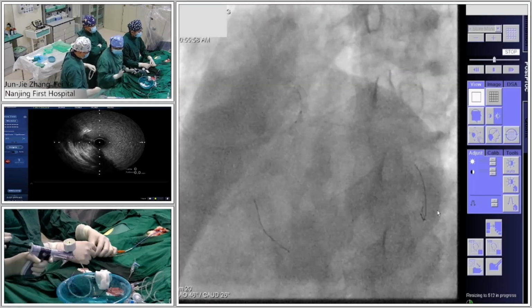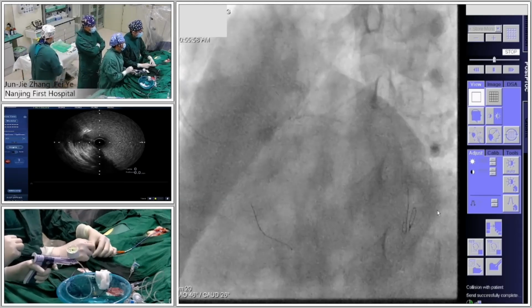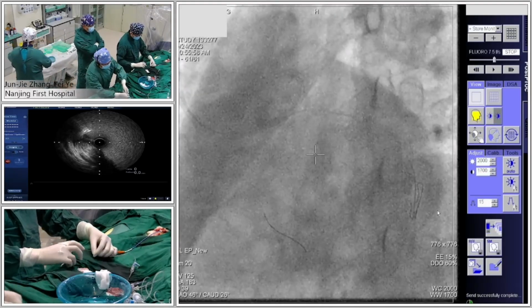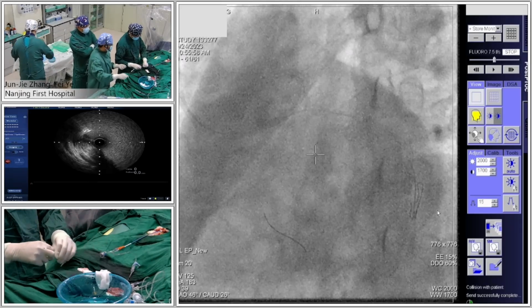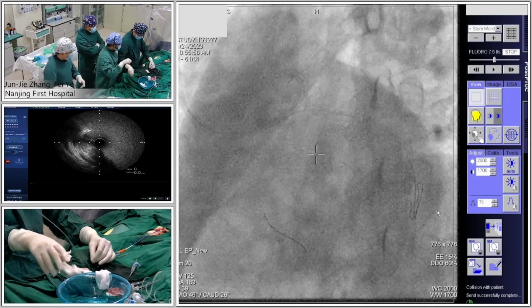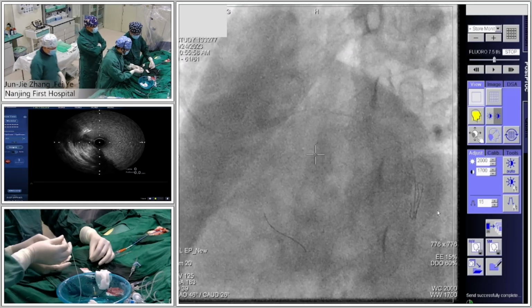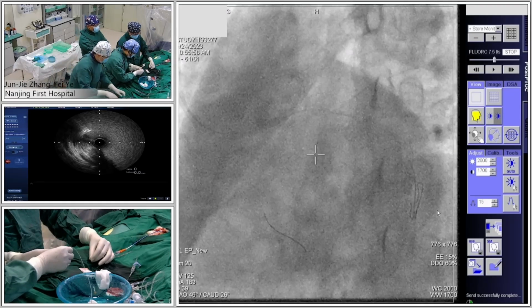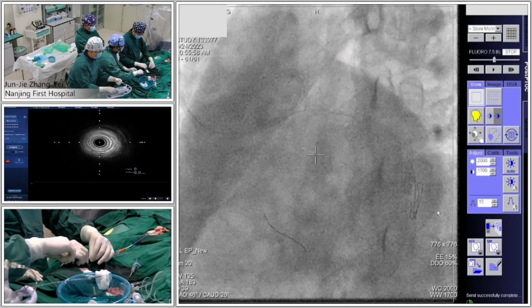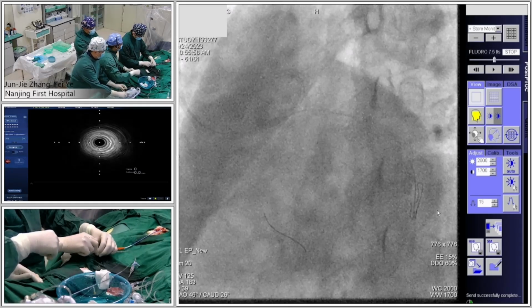What's the reason? Just because of the angulation. Now it's better, it looks smoother. So we check the IVUS. Maybe we have 5 minutes left. I think it's a very important step for DK crush, to precisely and accurately perform DK crush. This is a typical challenging CHIP case.